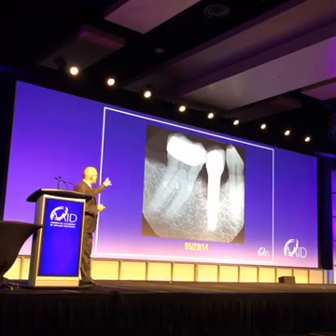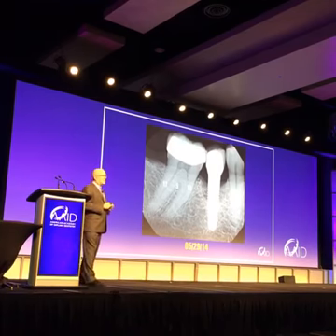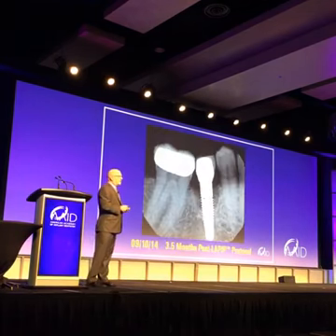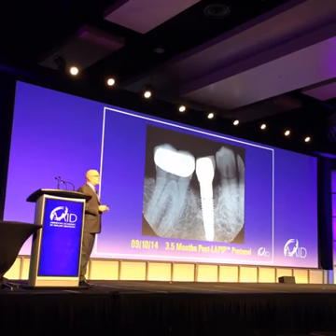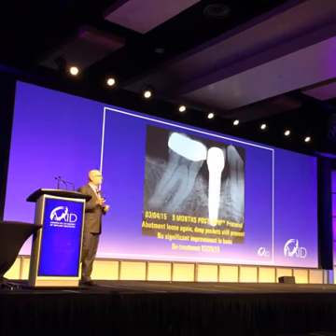The patient had a loose abutment. We saw there was bone loss around the implant. We decided to treat it with LAPIP. 3.5 months later, the bone loss is still there. I wasn't real happy with this. After a while, you kind of get an idea how things are supposed to heal in properly.